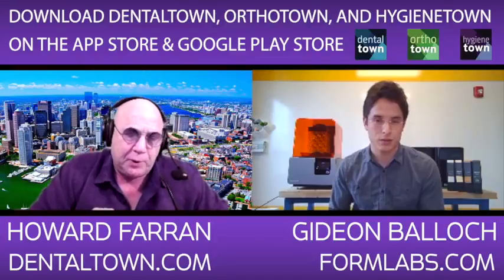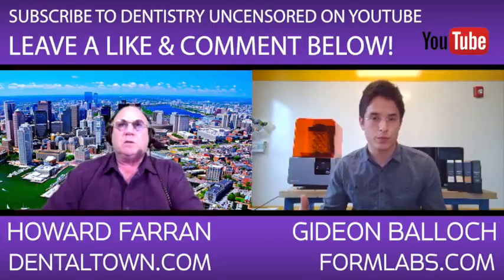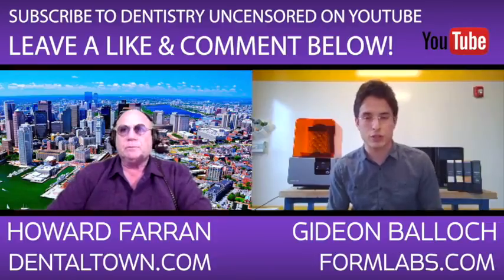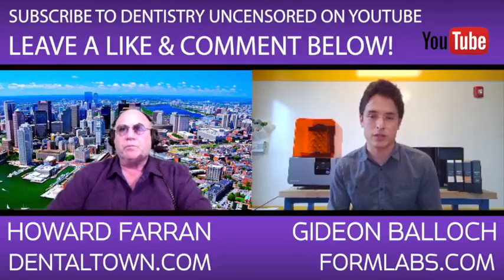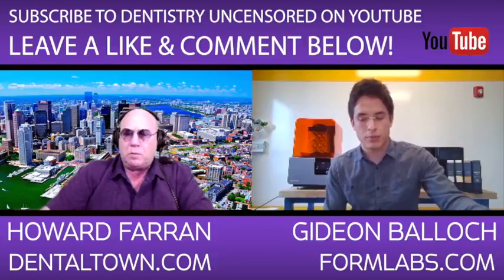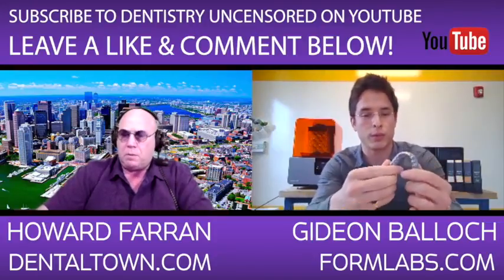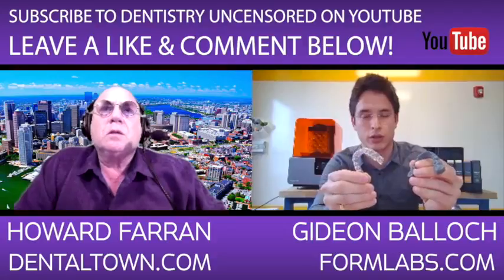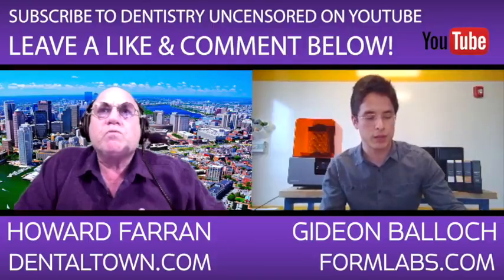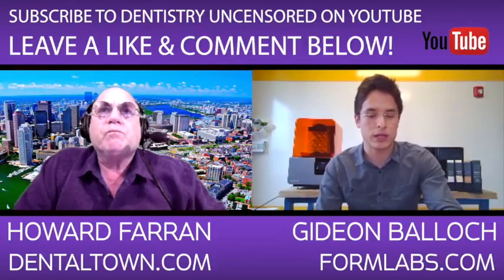And when you say you printed 1 million 3D printed dental parts, what are those parts? So there's a variety of things people are printing. For the office users, the main applications that are most interesting are the ones that are the simplest. And so that would be printing surgical guides like this one right here, printing splints like the one I was holding up earlier, or printing models that would be used for thermoforming clear aligners, like in this case. We have a clear aligner here. In addition to that, our lab users are doing more complex things, printing crown and bridge models with removable dies, printing diagnostic wax-ups and sending out those cases.